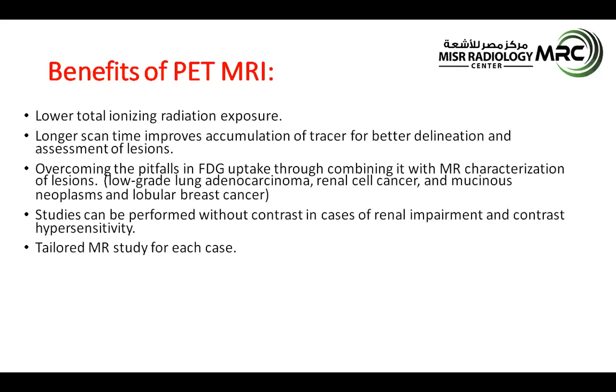We also perform tailored MR studies for each case. So a case of breast cancer differs from a case of lung cancer, from a case of prostate cancer. And this tailored protocol applied for the MR study gives us the edge of high resolution and important accurate data for local staging.